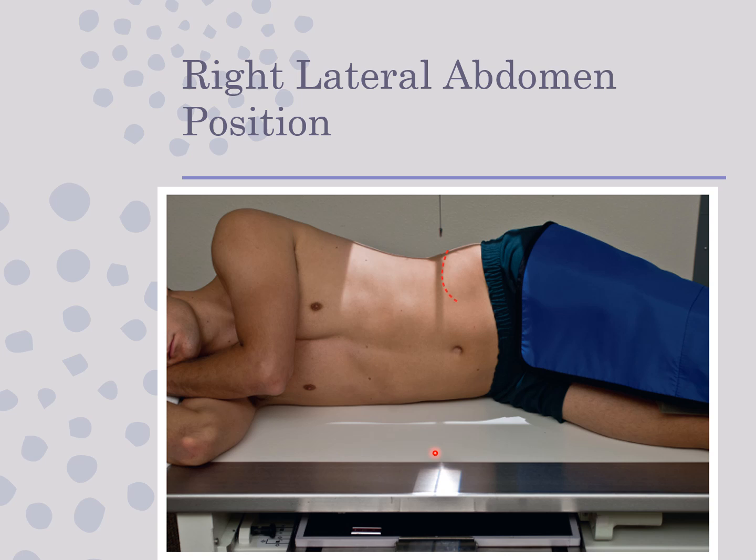Since the radiologists want diaphragm on everything, it forces us to almost do 2 images of pretty much every single patient. But aside from the supine abdomen, all other abdominal views, the decubes, the upright, this lateral, all of them, if the central ray is asked, it's 2 inches above iliac crest at midline.